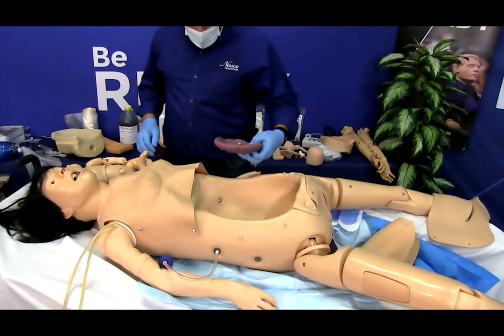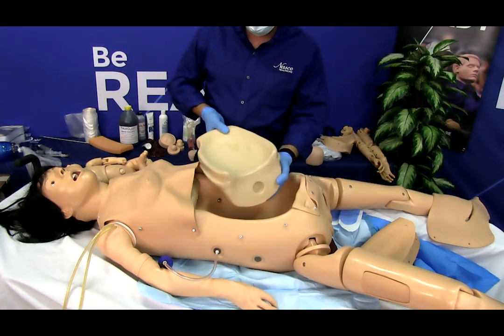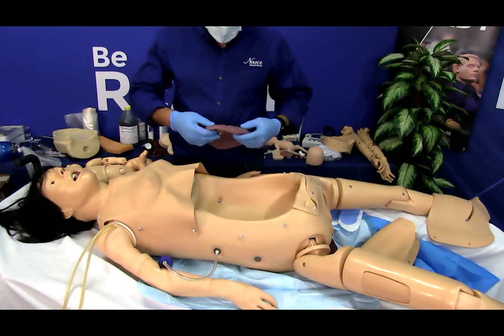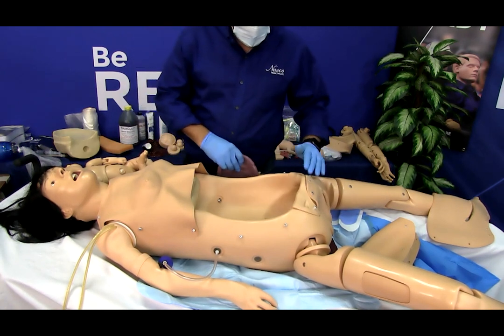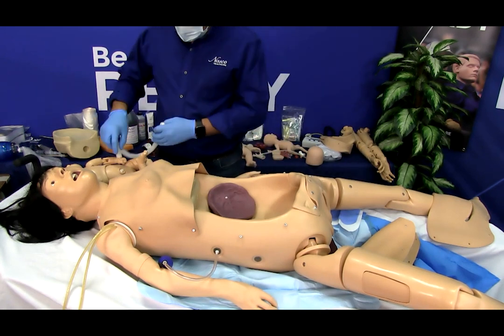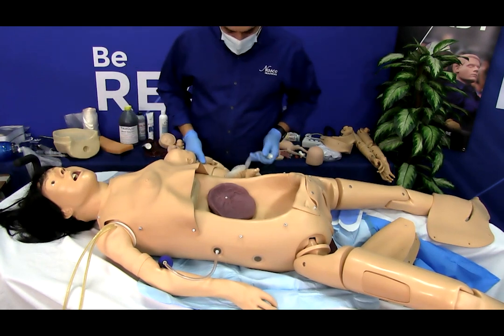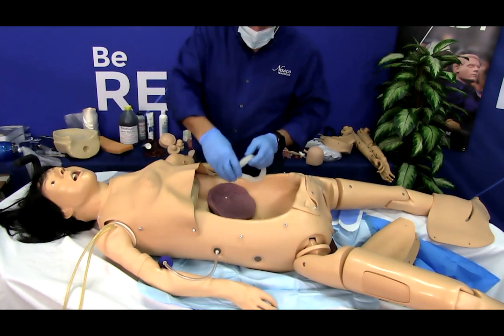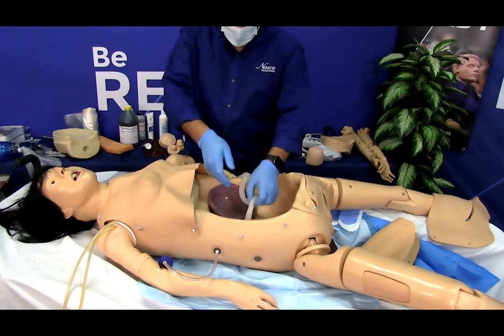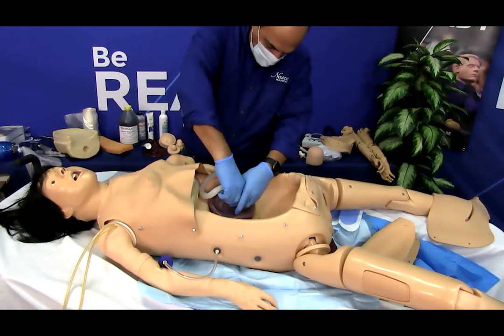To set up for a vaginal delivery, remove the pelvic block and perineal skin foam stabilizer pad from the torso and install the perineal birthing skin. Attach the placenta to the metal plate on the abdominal wall of the torso. Attach the long umbilical cord to the placenta. Connect a short umbilical cord for clamping and cutting to the long one.